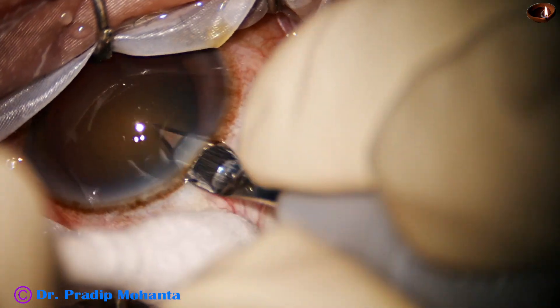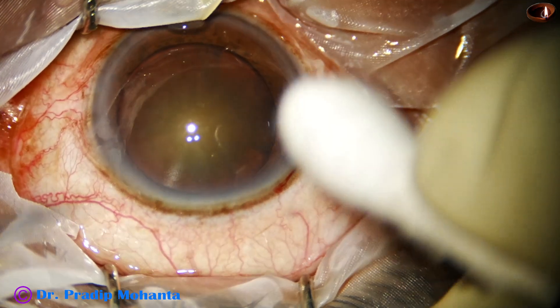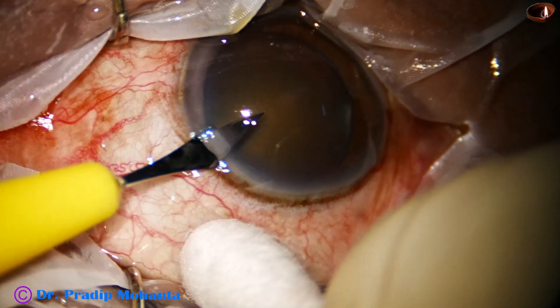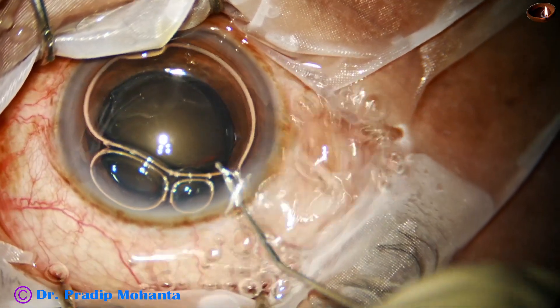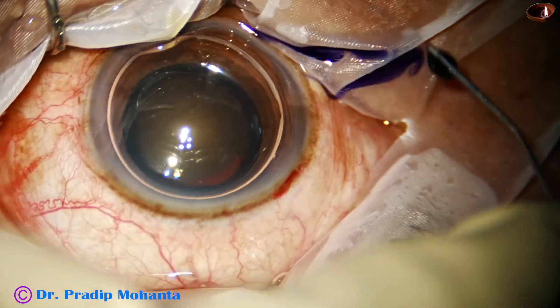In this case, I am trying for the first time the Appasamy Galaxy Pro FECO machine. I have used this machine in softer cataracts, but this is the first time I am using it for a hard cataract. Let us see how it goes.